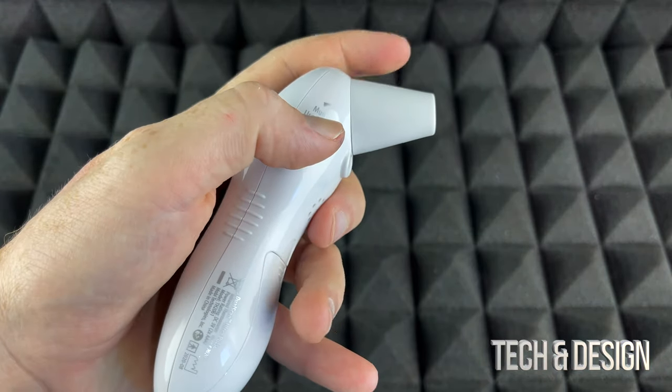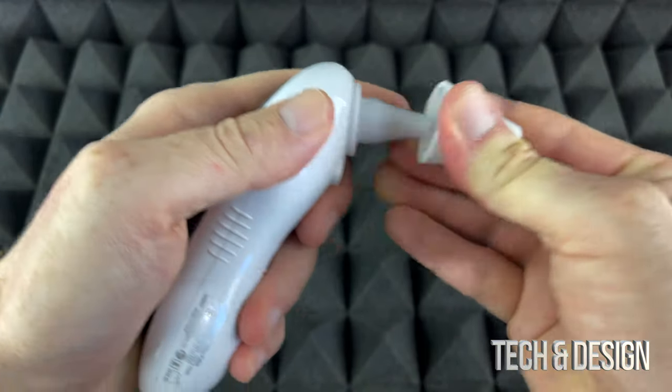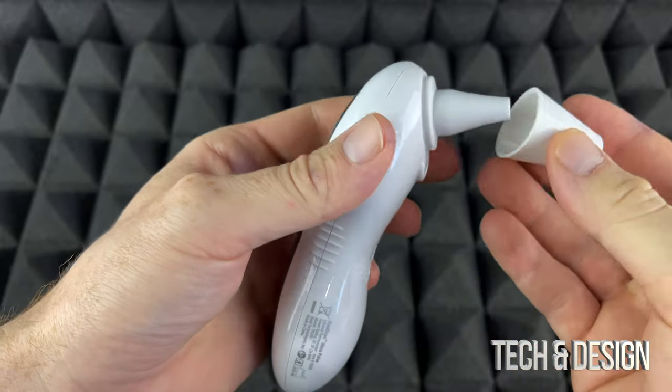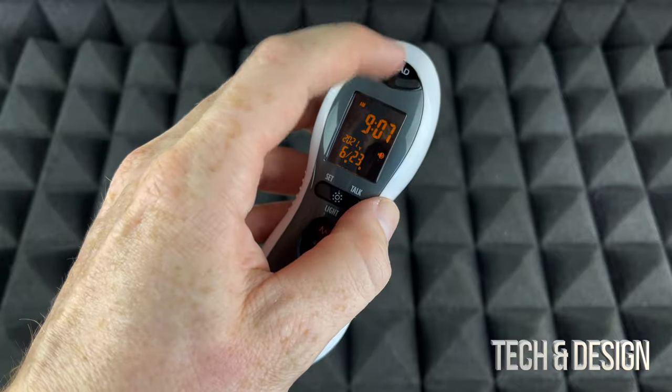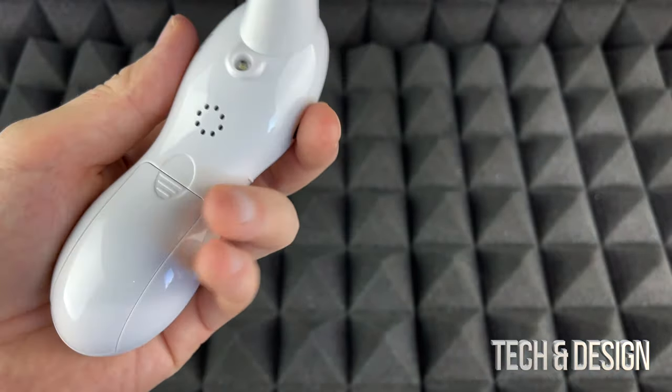To give you a quick idea of how this works: you point it at your forehead. If you want to do your ear, you take the cover off and press here. Right now we want to do just the forehead for a quick demo, and I'm going to point it at my head and press it.